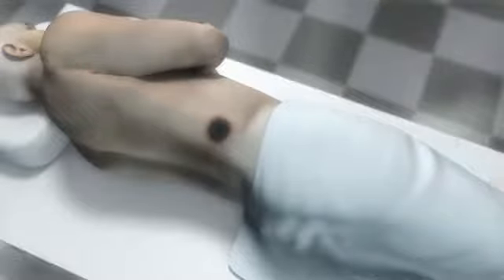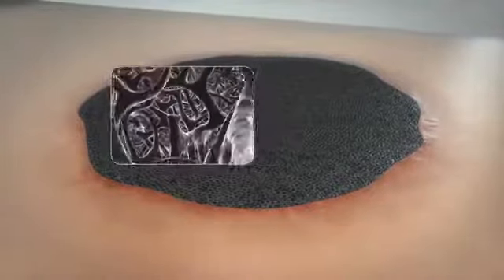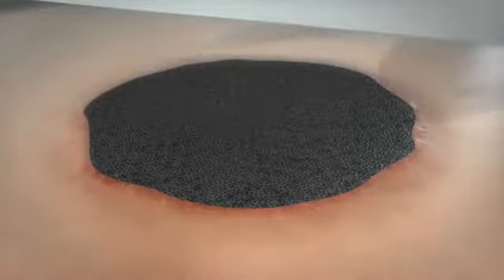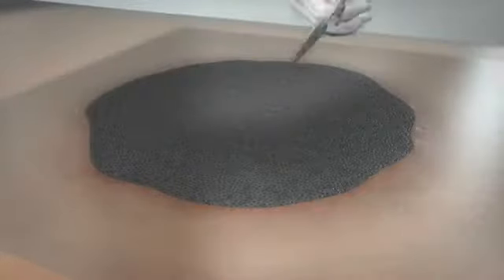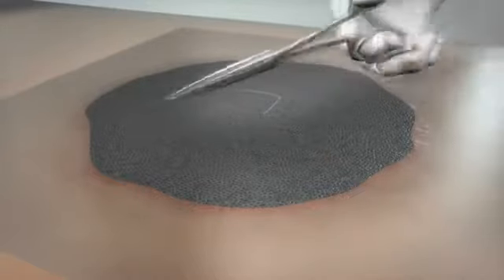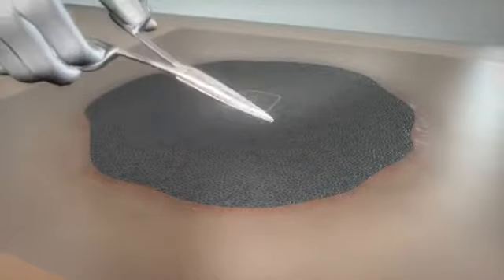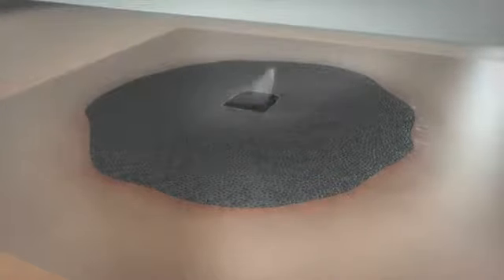When treating a wound using VAC therapy, the KCI proprietary GranuFoam dressing, which is a reticulated open cell foam, is placed directly into the wound bed. A semi-permeable drape is then used to seal the wound, provide a moist wound environment, and protect the wound from external contamination. The proprietary TRAC pad and tubing are then applied to the drape and provide the connection to the therapy unit.